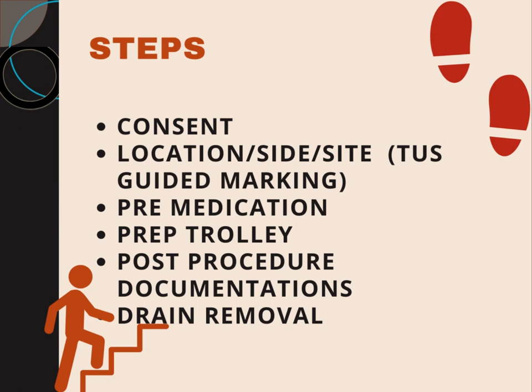The side is very important to avoid any sort of errors or complications later on in the procedure. Thoracic ultrasound guided marking if it is the procedure for pleural effusion or fluid collections. And then looking at the patient's attitude, if the patient is very agitated, whether you need to go with pre-medications in the form of Oromorph or midazolam to keep them a bit calm and comfortable during the procedure.